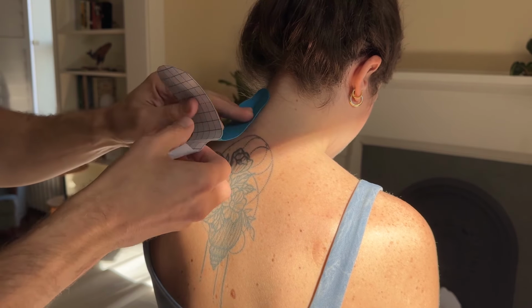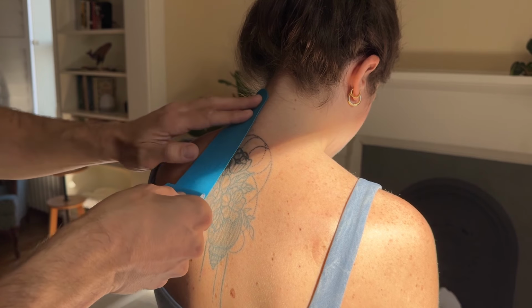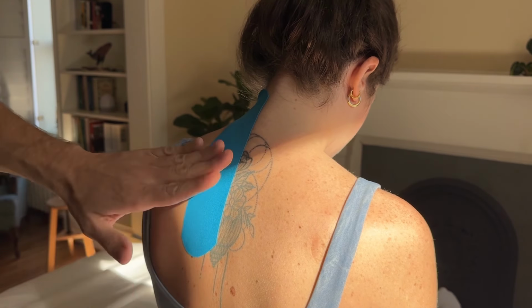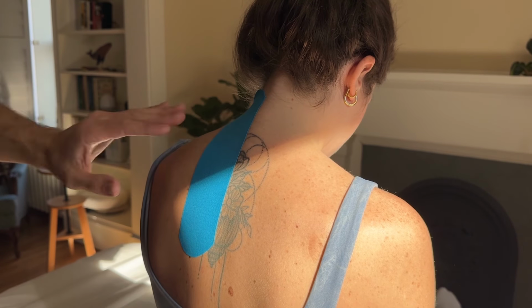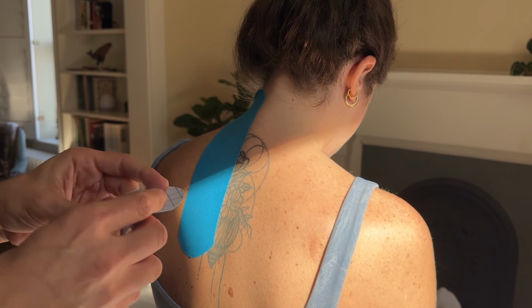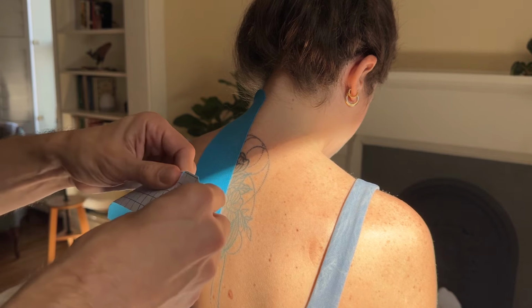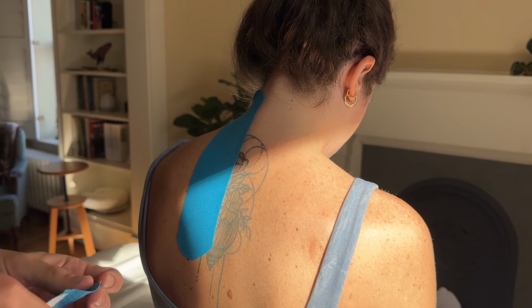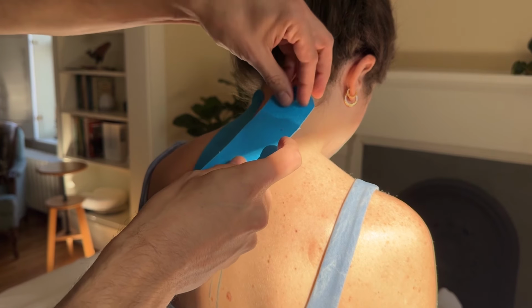Create an anchor, and then with little to no stretch, maybe 10%, you're going to lay the tape down just beside the spine and rub the tape to heat activate the glue. Now on the other side, you're going to do the same thing. You're going to break the paper off the edge. Just below the hairline, you're going to create the anchor point.